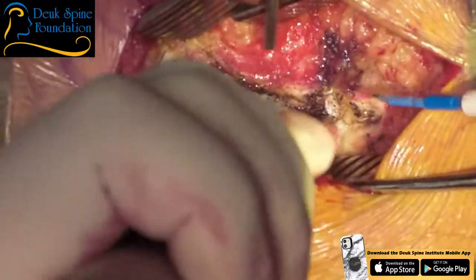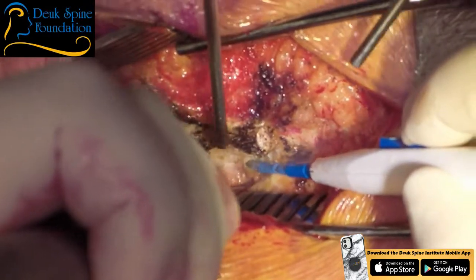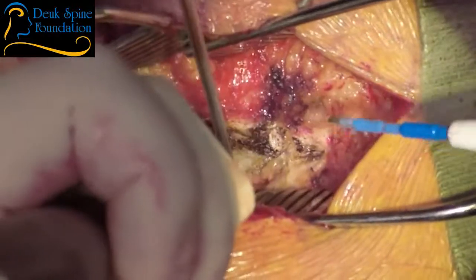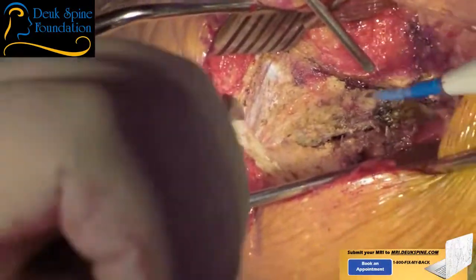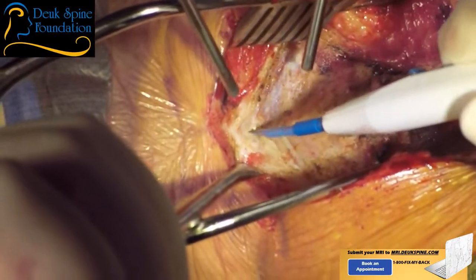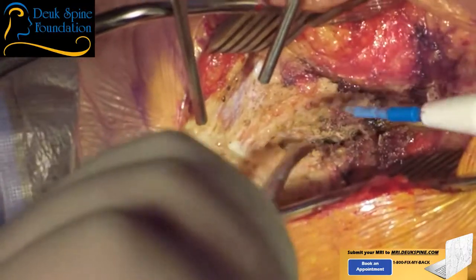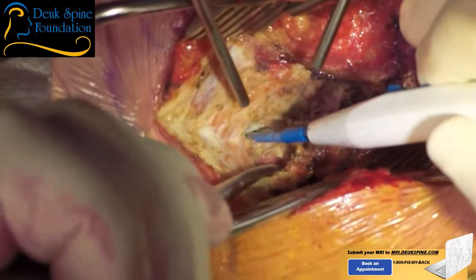So right now I think I'm seeing the C7 and T1 spinous process, which would be good from a standpoint of down here. We don't need to go any further south. But I think we have enough exposure north. I think we'll be fine. Remember, you want to stay between the muscles. Once you start cutting the muscles, you're going to get more bleeding and more pain, postoperative pain and suffering by the patient.